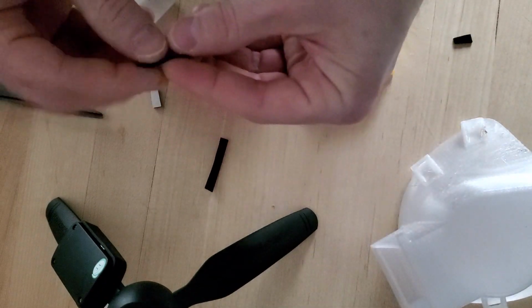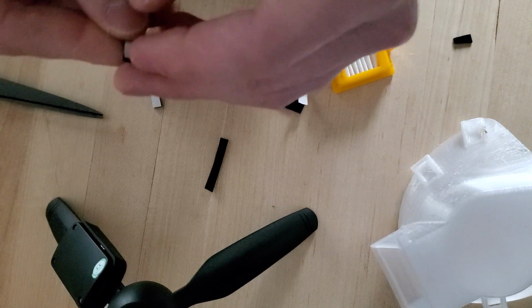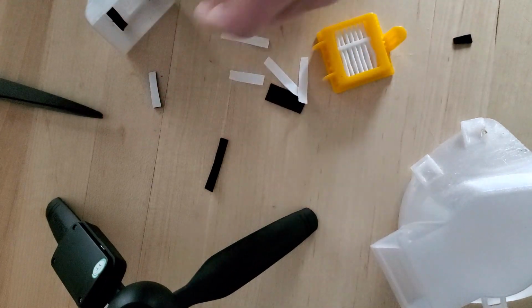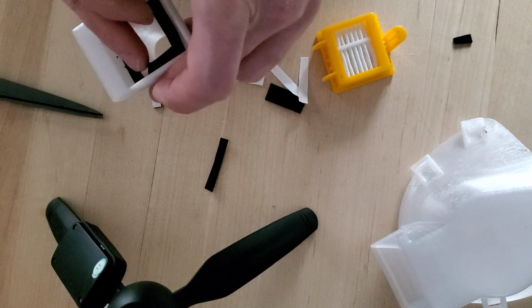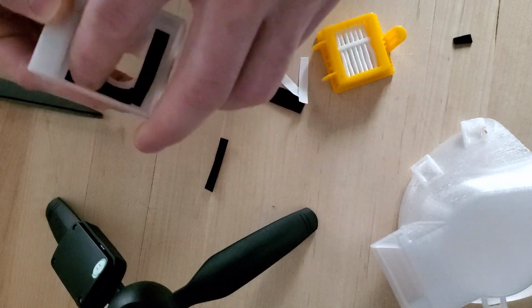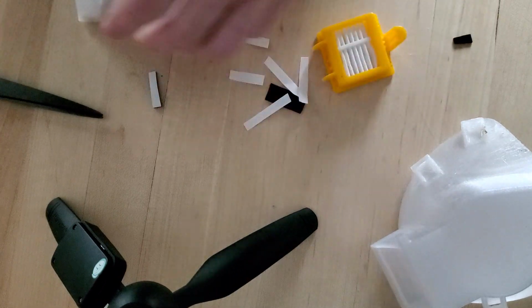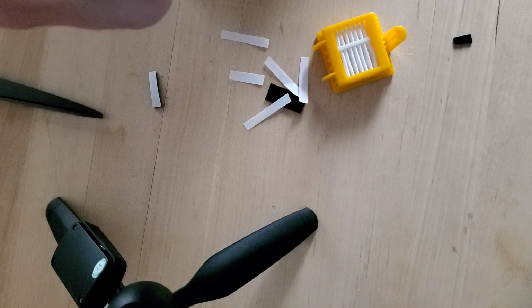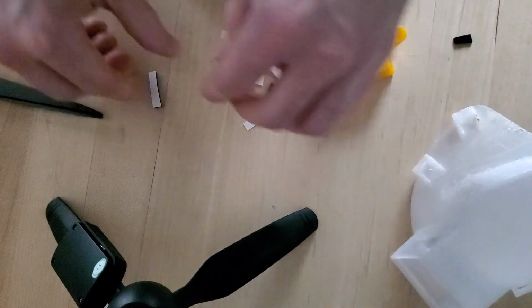Okay. You really want these to be touching each other, if possible, because you're basically making a membrane, or a gasket, sorry. That's not the piece I wanted. I'll use it now for this guy. This is the piece I wanted.